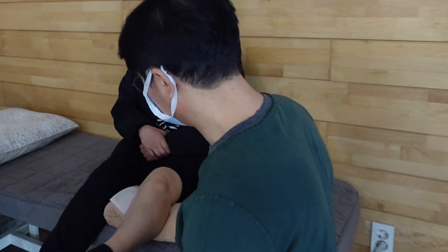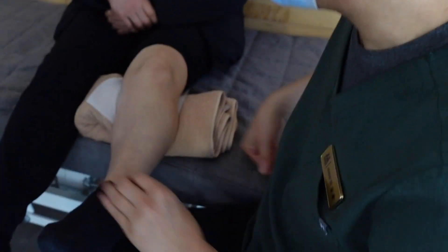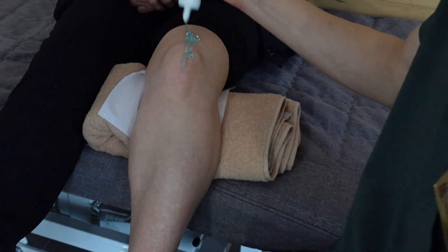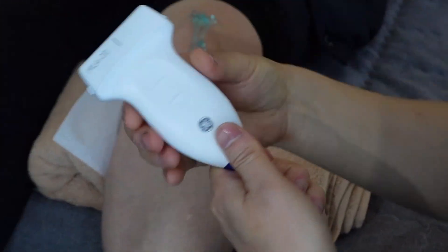Hello, and welcome to Practical Pain Management with Dr. Lee. Today, I will describe the ultrasound evaluation of the knee joint.